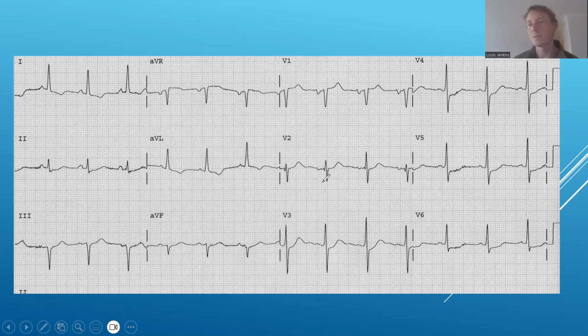That's called electrical alternans, and it means pericardial effusion. That's a cool thing to look up. But again, I'm fully digressing. I'm sorry I keep doing that. No one's here to keep me in check. I'm just ranting. Anyway, ECG.